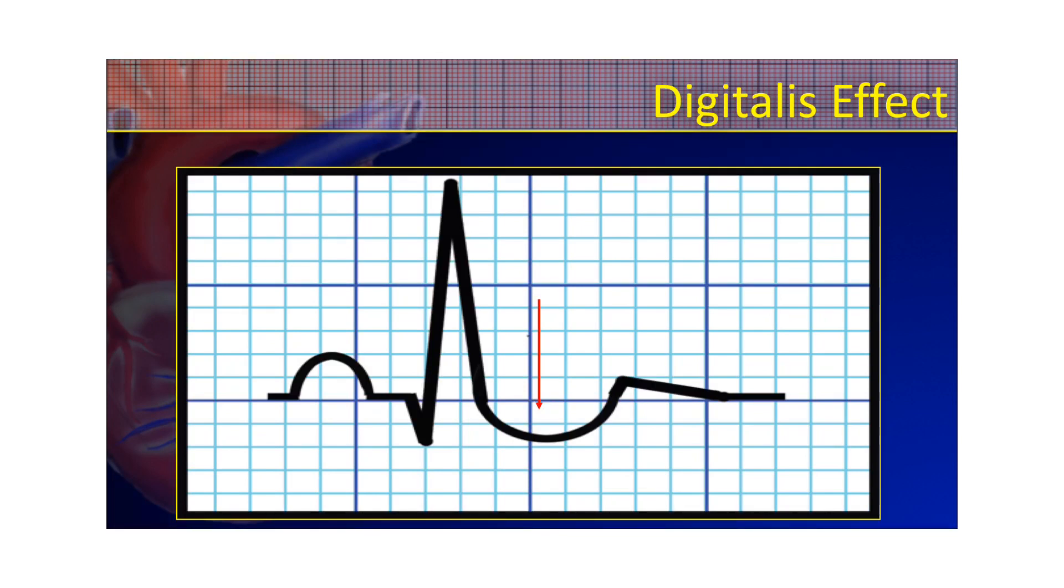I'll briefly explain the digitalis effect. I'm not going to spend a lot of time on this, because digitalis really isn't that prevalent of a medication as it used to be. But all it really is, is a scooped out appearance in that ST segment. That you can see here, that arrow is pointing to it. So this scooped out appearance, that can cause a little bit of ST depression. It's what they call the digitalis effect. It looks like somebody took an ice cream scooper and just scooped out that ST segment.